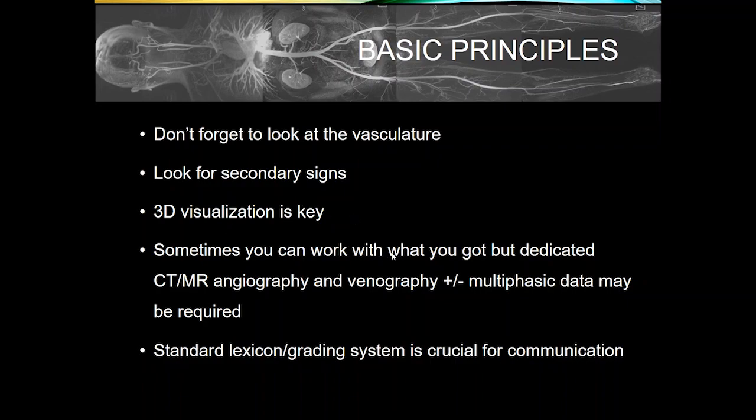Sometimes you can really work with what you have and make a diagnosis, but you have to know your limitations and when dedicated CTA and MRA are necessary. A standard lexicon and a grading system is crucial for communication. For example, at our institution, at the bottom of all our angiogram reports, we have a definition of what we mean by mild, moderate, and severe, and my radiology colleagues all use a similar lexicon.